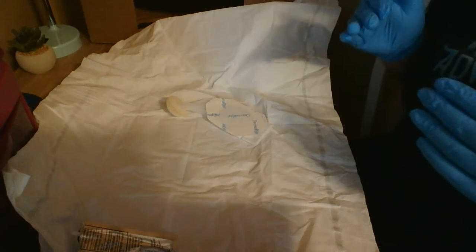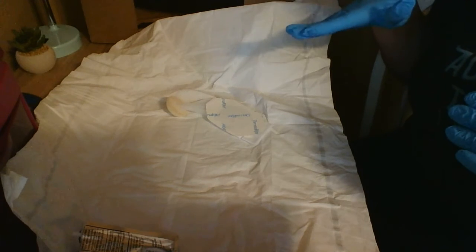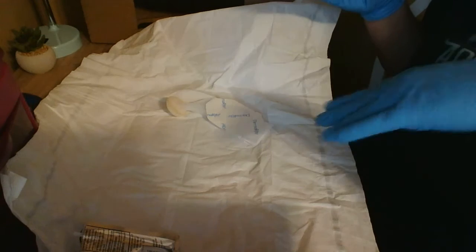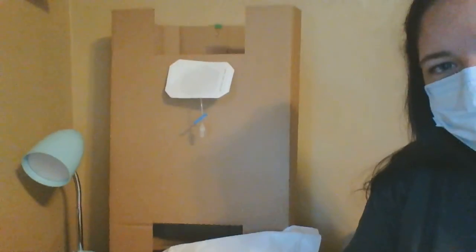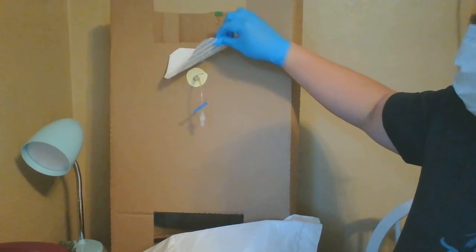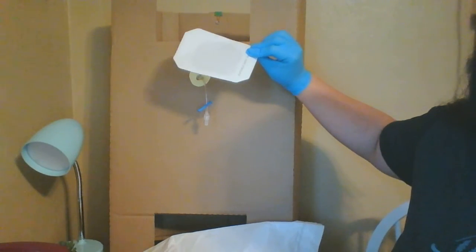So to keep it sterile, one hand I'll make non-sterile by touching the tube and the old dressing, and then this will be my sterile hand where I do all the cleaning. So I just want to go ahead and remove my dressing. So I'll just go ahead and finish removing my dressing.